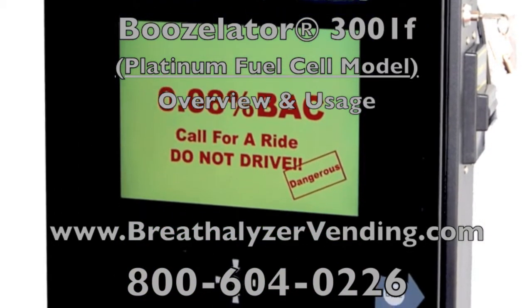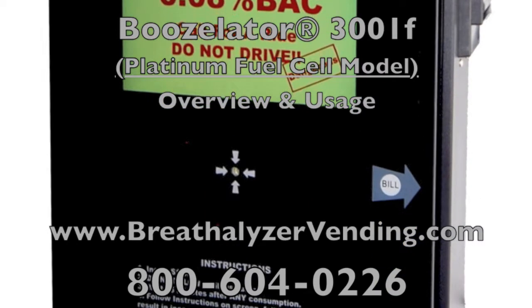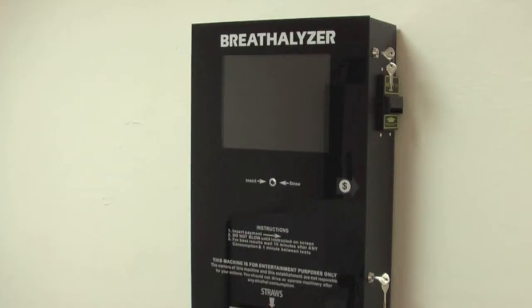Welcome! In today's video, we'll be giving you a brief overview of the Boozellator, both in and out, and demonstrating how the breath testing process works on the machine.